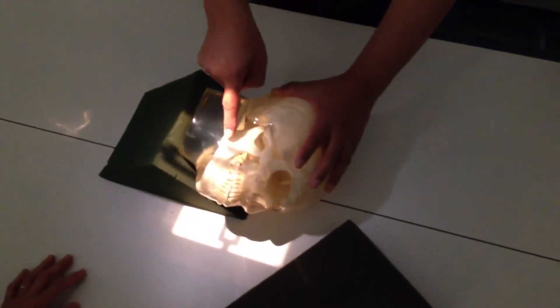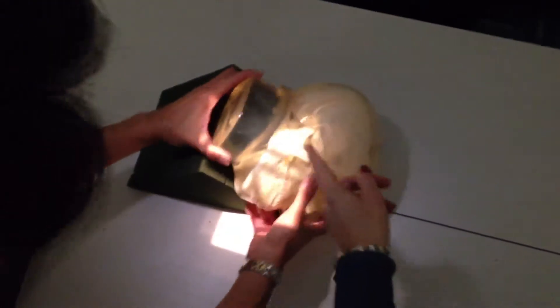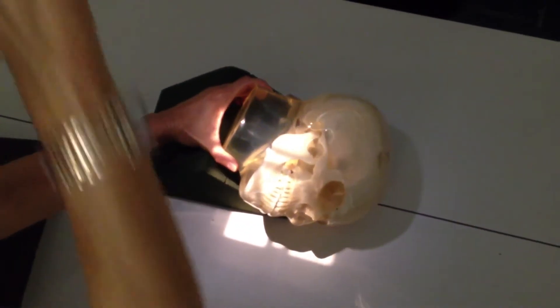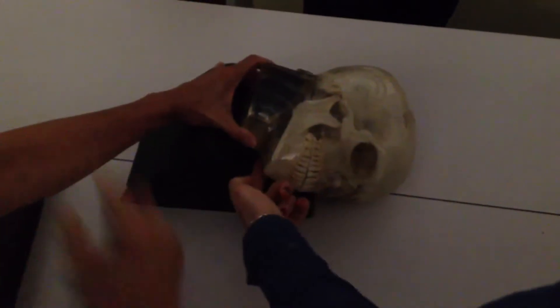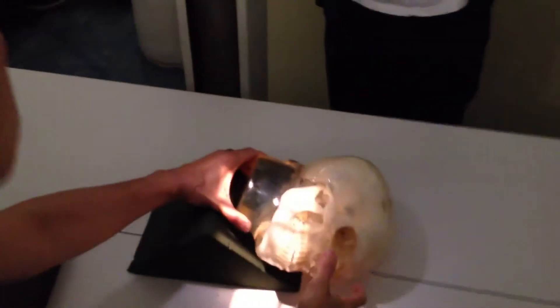You might think it's going to superimpose, but it won't — I promise you. For central ray, I want you to go between gonians. Between gonians — just do it just enough to separate, because the angle separates it more. I don't want too much of this, because that's too much. Between gonians means this one and... right about right here. Pay attention to your shadows.